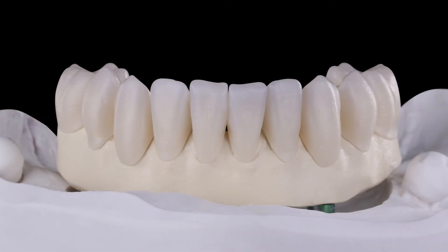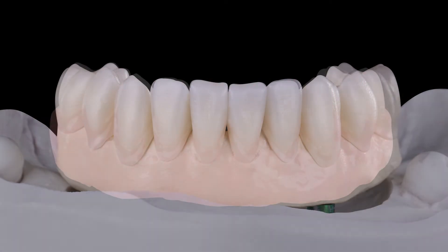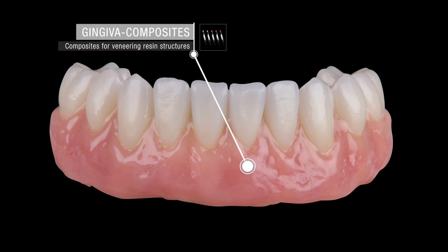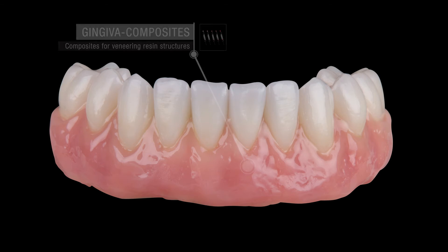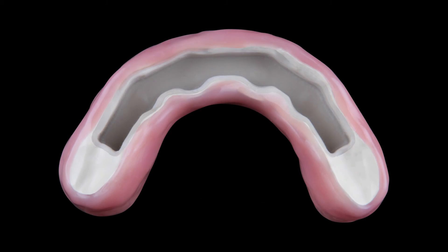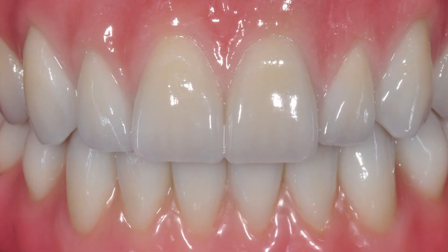For the aesthetic finalization of the structure, the gingiva was layered with gingiva composites. Finally, the friction coping was bonded inside the structure and the final restoration was inserted with friction into the patient's mouth.